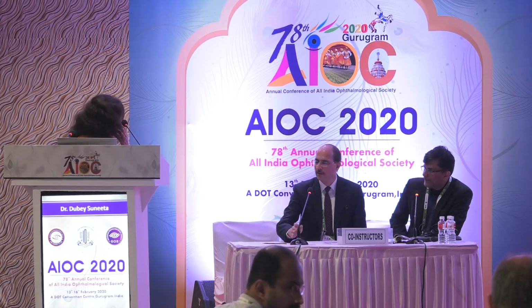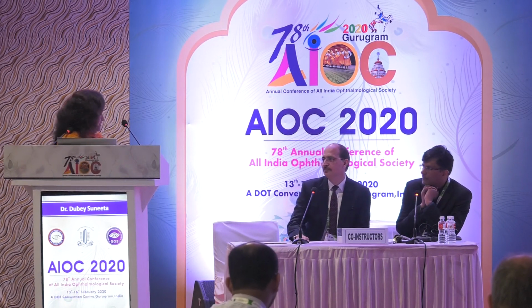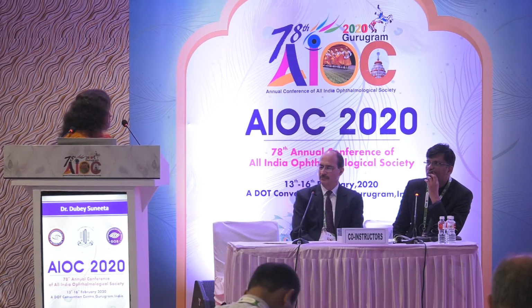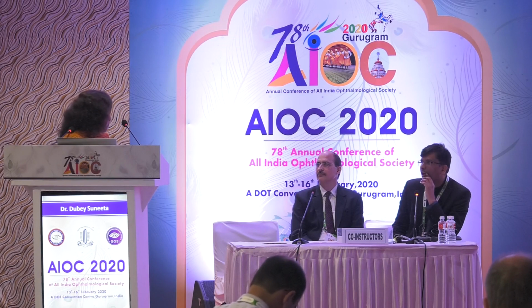Dr. Pandav? Yeah, I think excellent videos, and you seem to have a preference for putting the tube into the sulcus. So why do you do that? And do you always put it in the sulcus? No, not always. If the patient is pseudophakic, and if the pupil is dilated, because most of the patients which we do are complicated glaucomas, neovascular glaucoma, the post-PK glaucoma where the pupil is dilated, there's a lot of space between the iris and the lens. So there you get enough space to put the tube, and the tube will slip in very easily, and the chances of tube corneal contact are minimal.